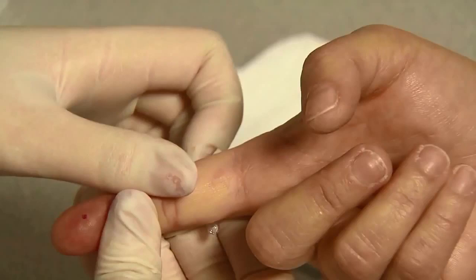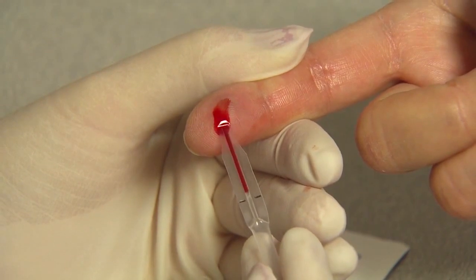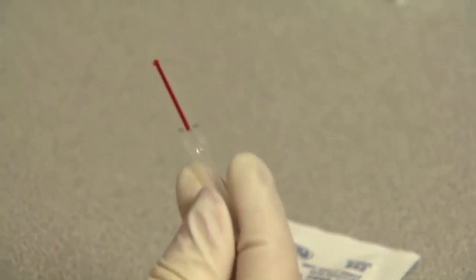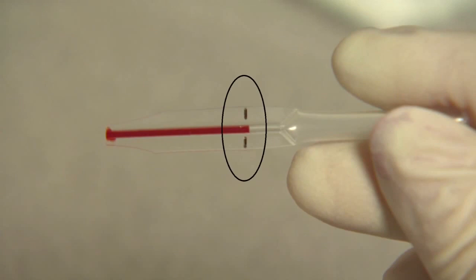Do not apply specimen sample directly on the test strip. Collect capillary blood of 10 microliters using a capillary transfer tube or pipette. The capillary transfer tube will fill automatically. It is important to use the capillary transfer tube to collect specimen in order to receive accurate results. Make sure the blood covers the air vent of the tube or it will be difficult to squeeze the blood out. Never squeeze the capillary transfer tube while sampling.